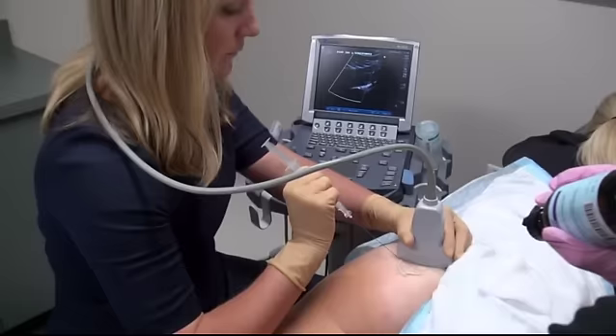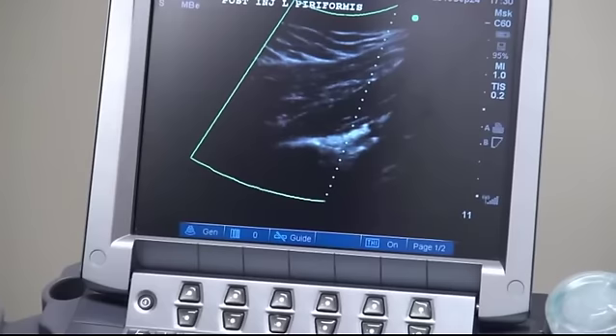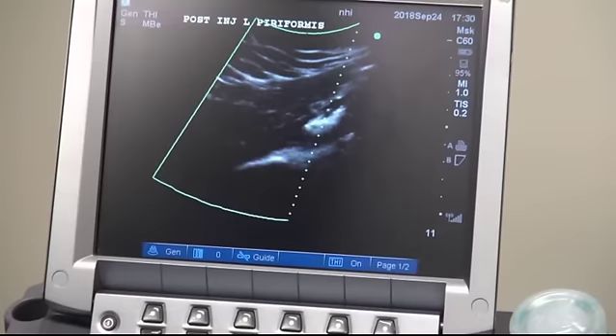Once the needle is in place, the medication can be injected and visualized entering the muscle tissue. Once complete, the needle is removed. Typically an image is stored and the remaining ultrasound gel can be wiped away. The medical pad can then be removed and a bandage can be applied.